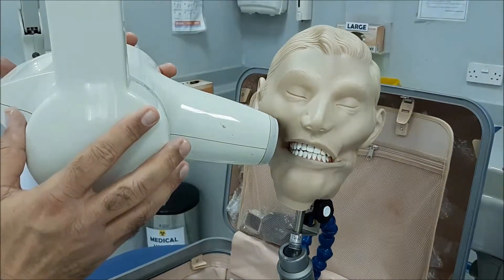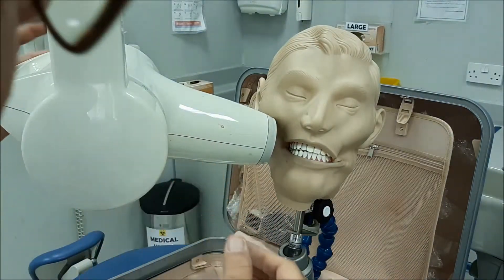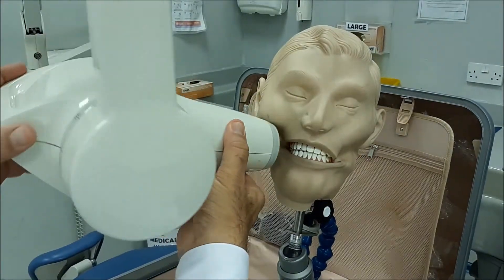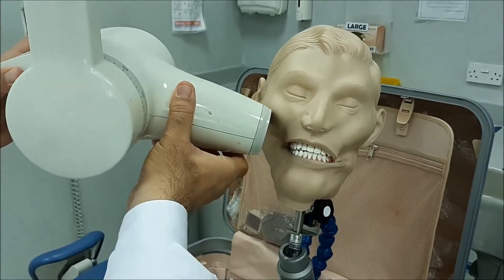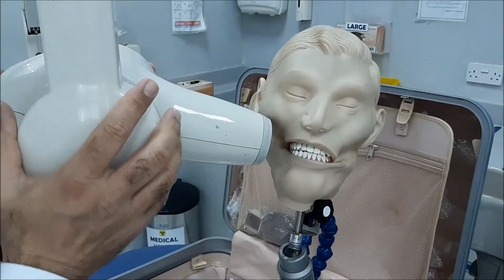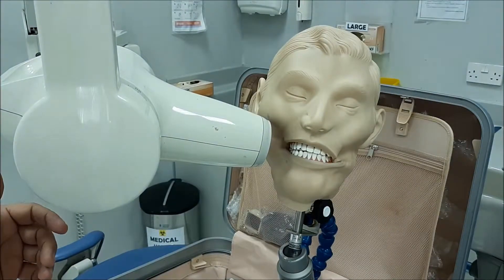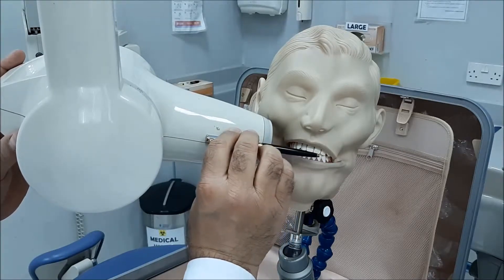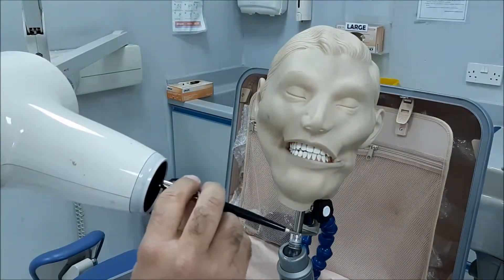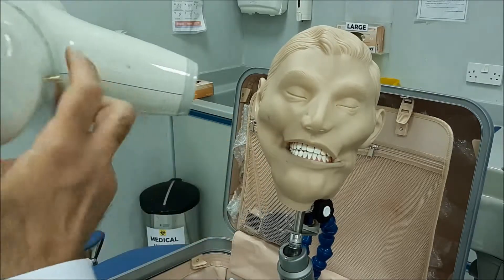The second consideration is horizontal angulation. Since you cannot see the film, you stand in front of the patient and move your cone — with the vertical angulation fixed — either mesially or distally, so that the beam ends up perpendicular to the buccal surface of the teeth. To assure this, use the pen theory: imagine a pen emerging from the x-ray beam and try to make it pass between the teeth.